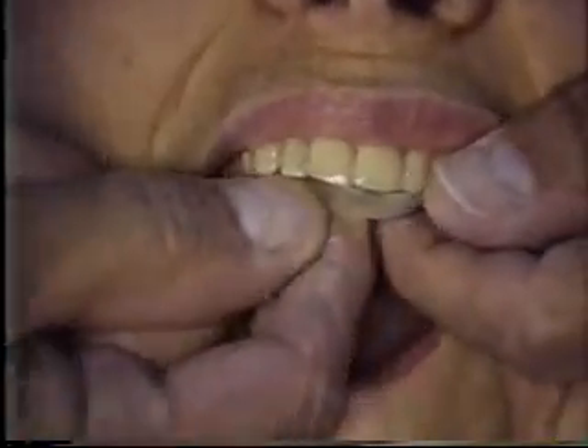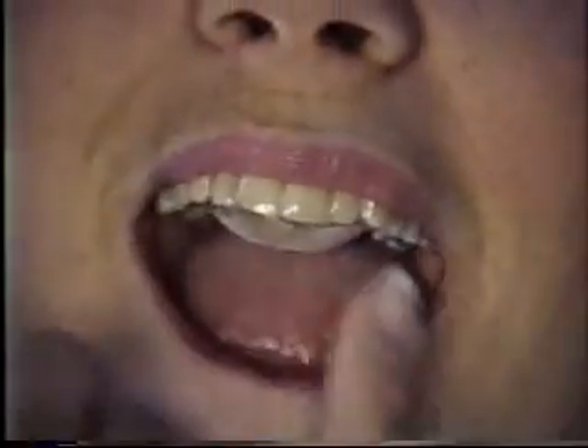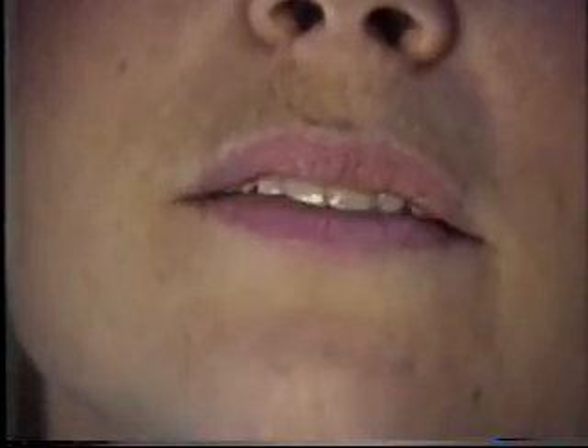When we take it out — how do you get it out? You know how to do it better than I do. Now I put my fingers in their ears and close again, and I feel tremendous clicking, mostly on the right but on both sides.